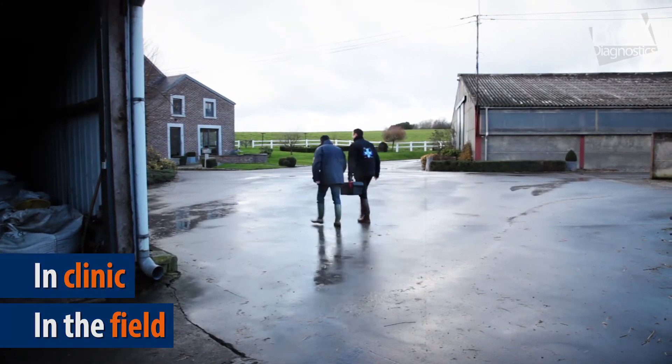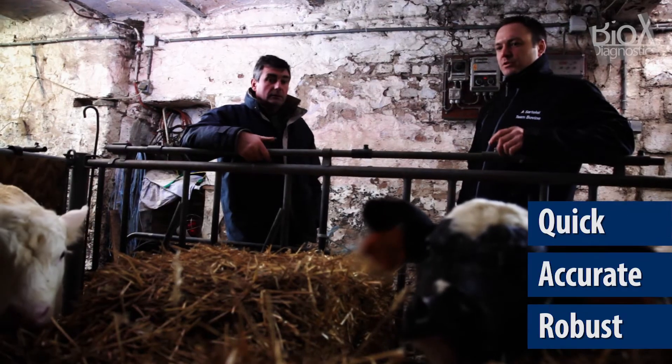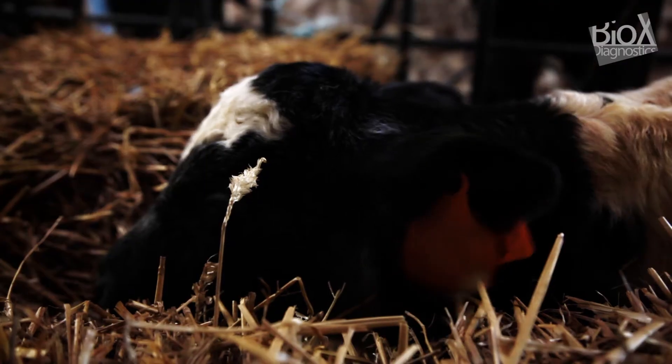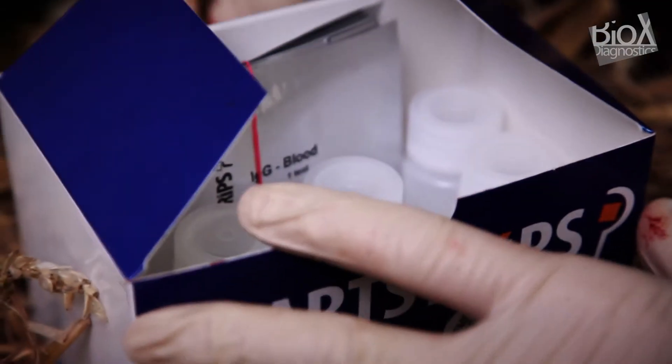Let's imagine you are visiting a farm that has a recurrent problem of neonatal enteritis. Risk factors have to be assessed quickly, in particular the transfer of immunity. For this reason you need accurate and reliable data in a minimal time. SmartStrips IgG perfectly meets your needs.